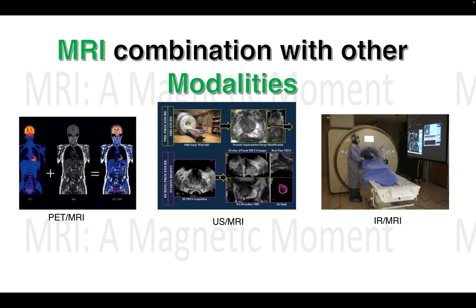So, it's very detailed, high resolution images produced by the combination of magnetic resonance imaging and PET scanning. And these high quality images of MRI with the metabolic details collected by PET scans pinpoint the exact location of tumors in cancer patients.